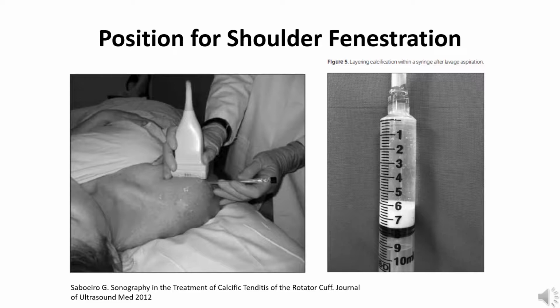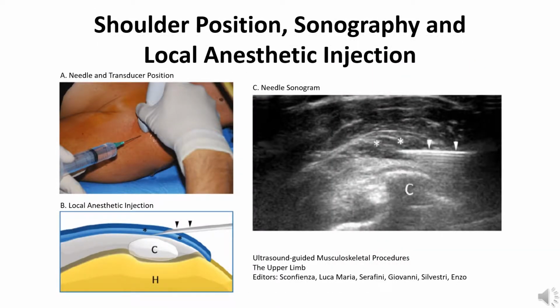On the right hand side of the screen, you'll notice the calcium deposits that were aspirated after barbotage and lavage.